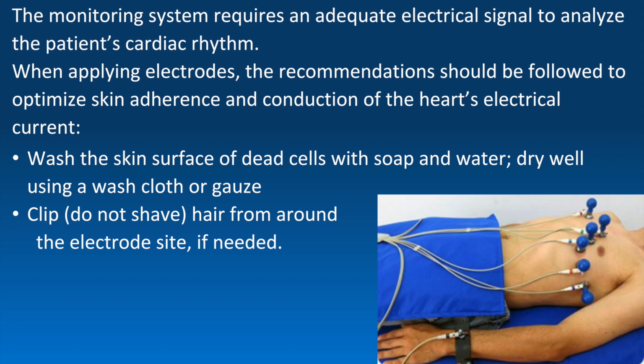When applying electrodes, the recommendations should be followed to optimize skin adherence and conduction of the heart's electrical current. The recommendations are: wash the skin surface of dead cells with soap and water. Dry well using a washcloth or gauze. Clip hair from around the electrode site if needed.